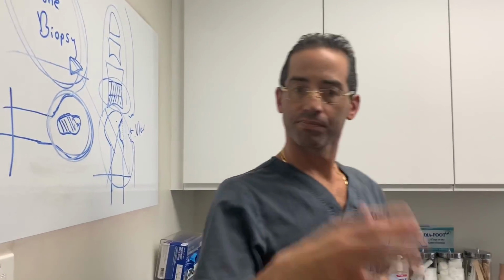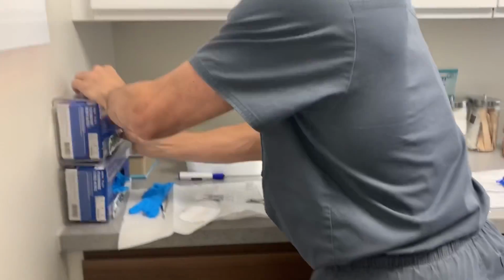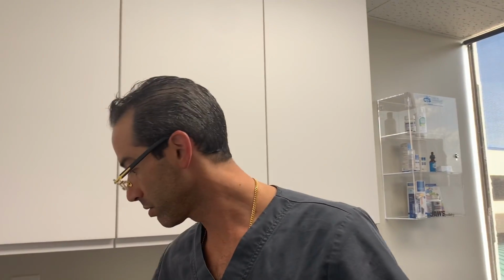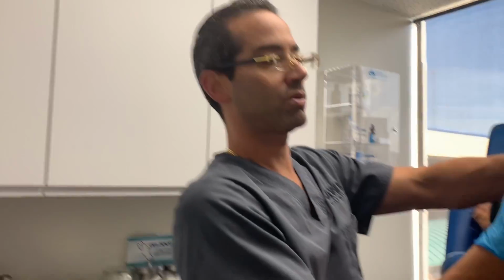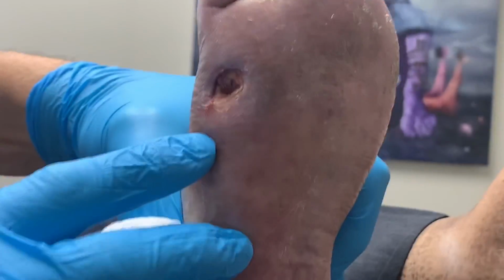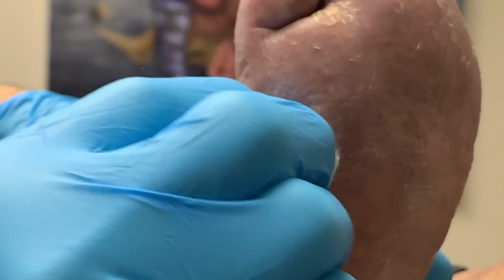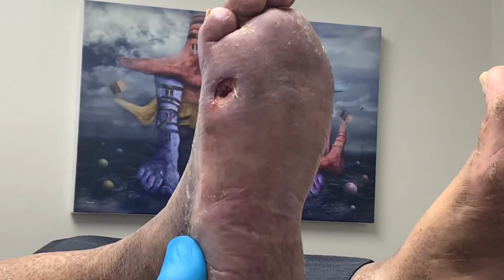So I'm going to come around, Patty. I want to send him to the hospital. I can't do the MRI because he's got the stents. I don't want to send him to the operating room either, unless we really have to. There's the bone, right there. Okay, that's the bone. My young friend, can you hold your leg right there? Okay, good.